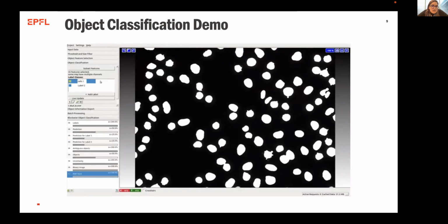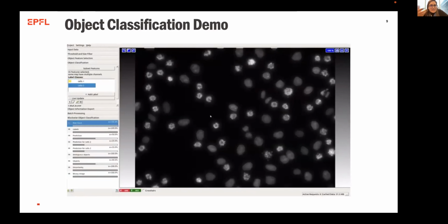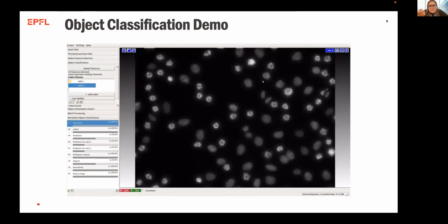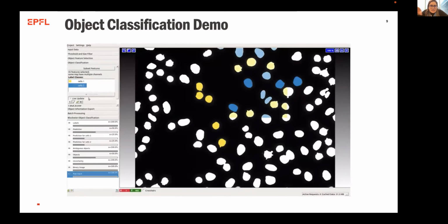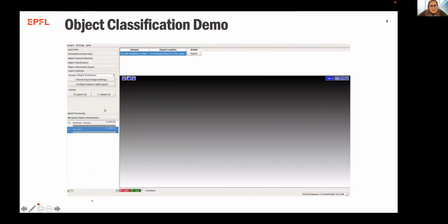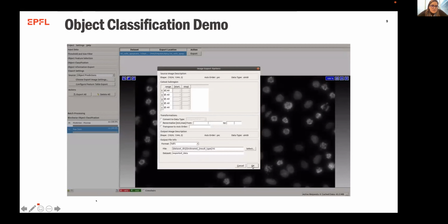And then to improve, first you can improve the pixel classification, and second you can add on top of this classification an object classification. So we were able to get these objects, and then we have two different categories within the same object. So we can again label, annotate, predict live, then correct and iterate.